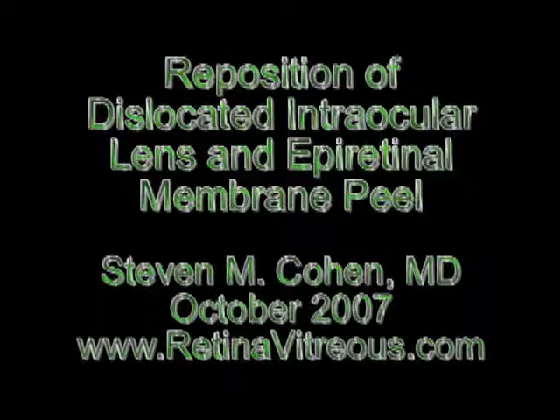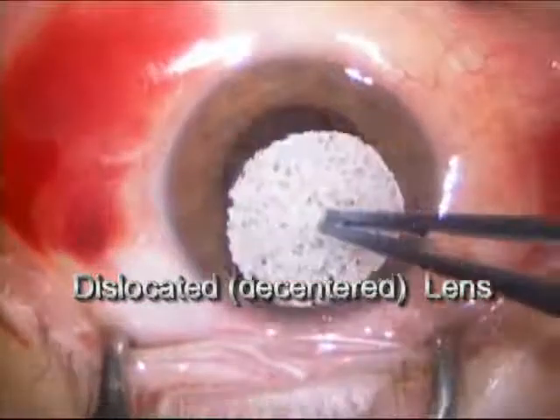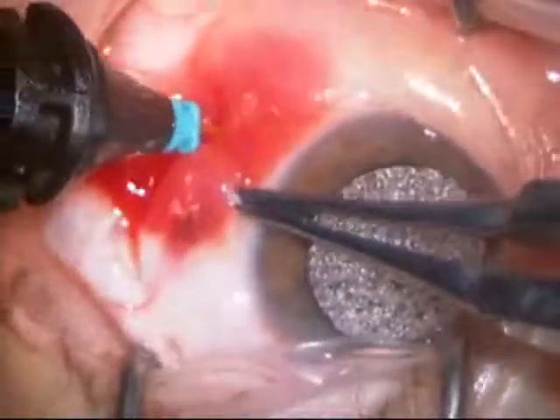Welcome. I'm Dr. Stephen Cohen. What you're about to see is a videotape of a surgery which involved two procedures. One was repairing a dislocated, decentered intraocular lens, and the second is removing a macular pucker.